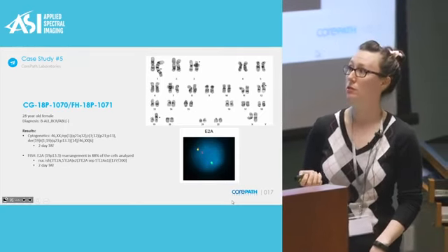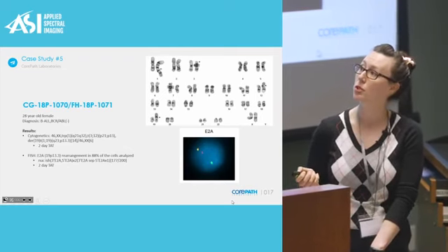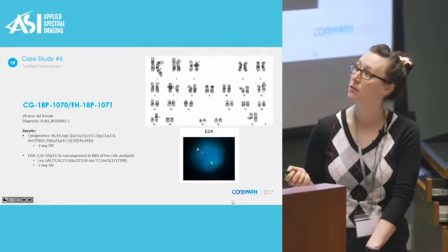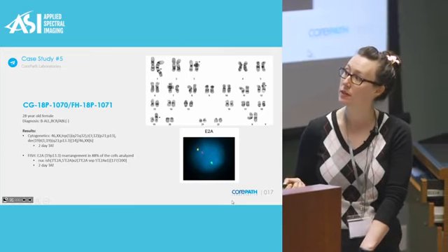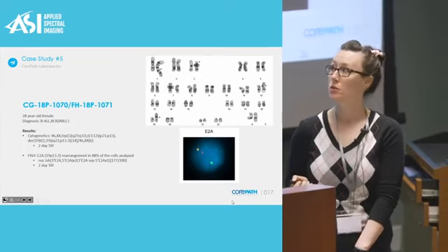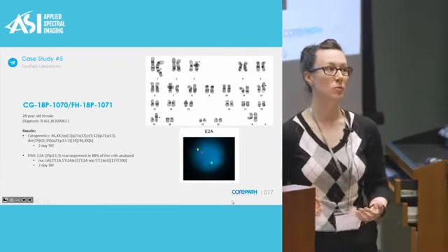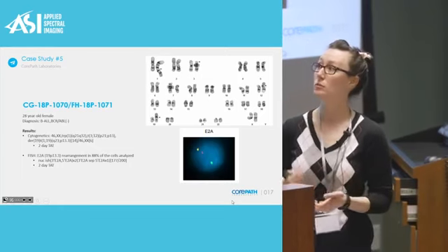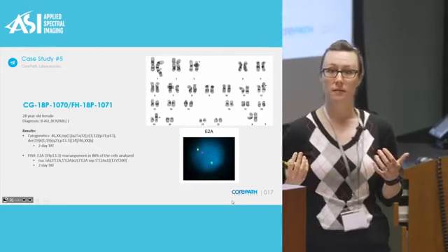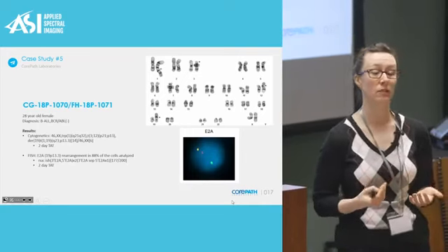Now, cytogenetics also showed some interesting abnormalities. We have a triplication of the 1q on chromosome 1. We have a translocation between the 3p and 12p, in addition to a derivative 19 resulting from a translocation 1;19. So we knew that E2A was abnormal, but we also know how it's abnormal now. We know that it's abnormal because it was involved in a translocation between the 1q and the 19p, disrupting that region. This is another great example of how the testing types go together to provide a more clear and accurate diagnosis for this patient.